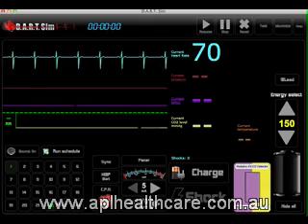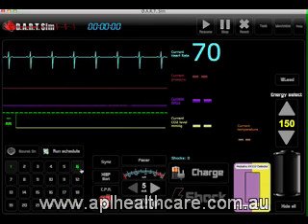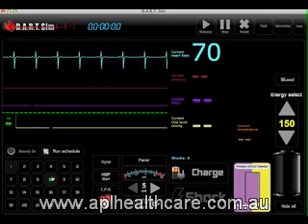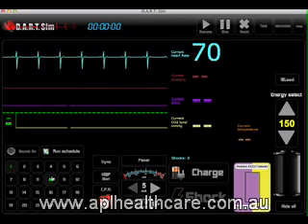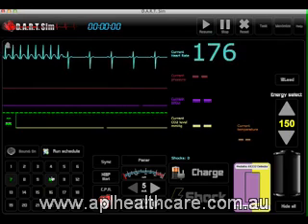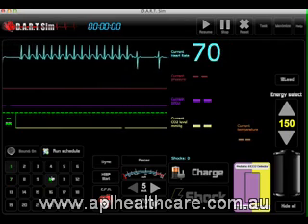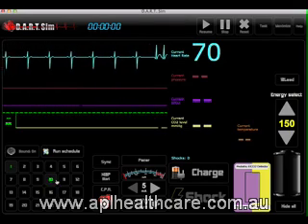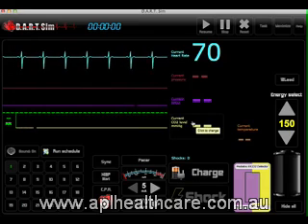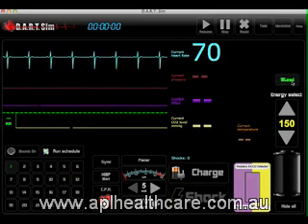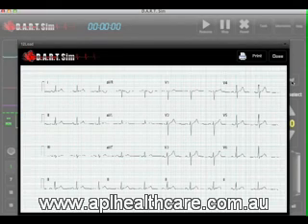You can also change the rhythm by holding down the shift key and entering the desired rhythm number. We also have a 12-lead function, so whatever rhythm is being displayed, just simply tap on the 12-lead button here and it will display a 12-lead of that rhythm.